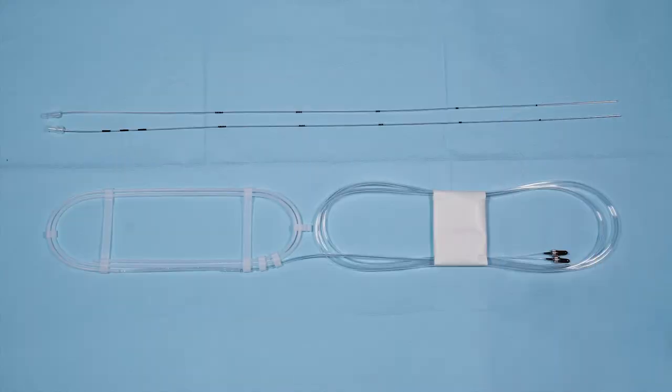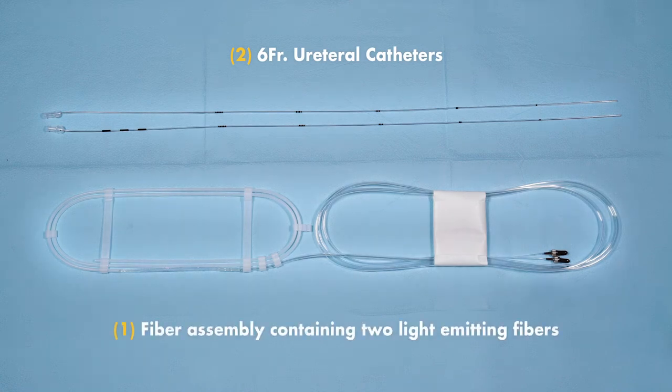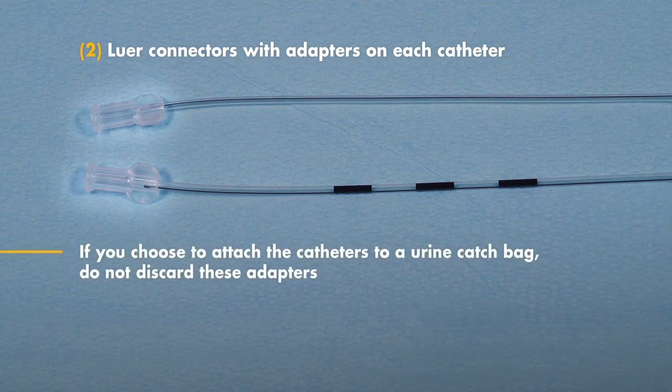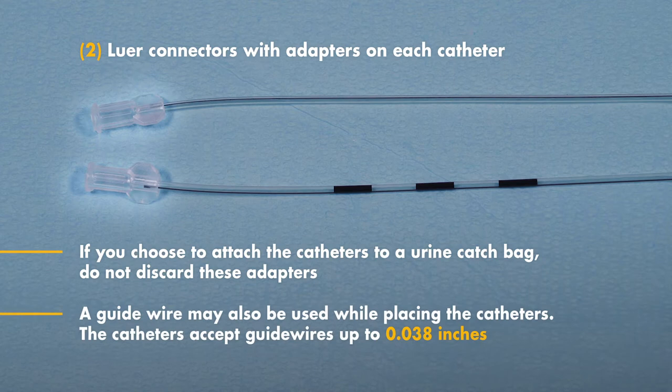Each Iris ureteral kit includes two 6 French ureteral catheters, one fiber assembly containing two light emitting fibers, and two luer connectors, which provide a wider opening for fiber insertion. If you choose to attach the catheters to an adapter and urine catch bag, do not discard these luer connectors. Each catheter has insertion depth markings to help with internal placement, an open distal end to facilitate fluid drainage, and accepts guide wires up to .038 inches.